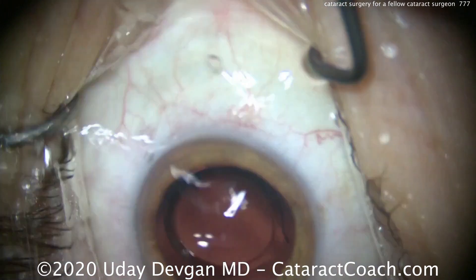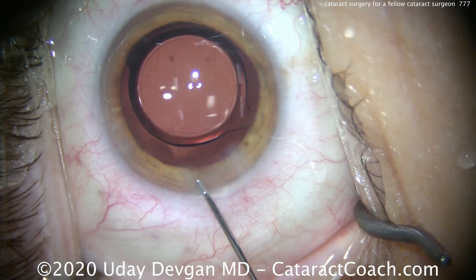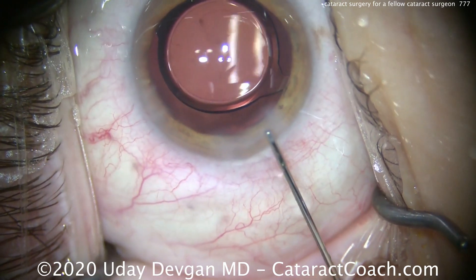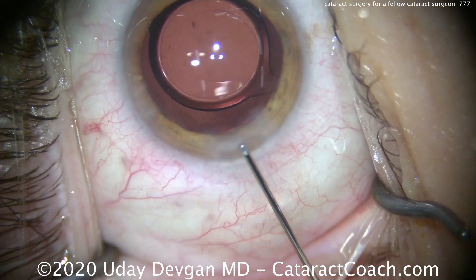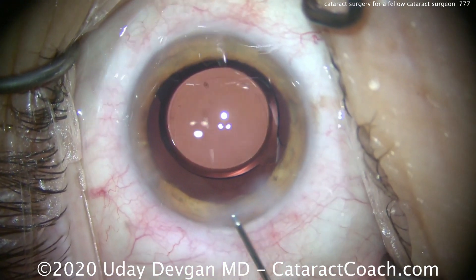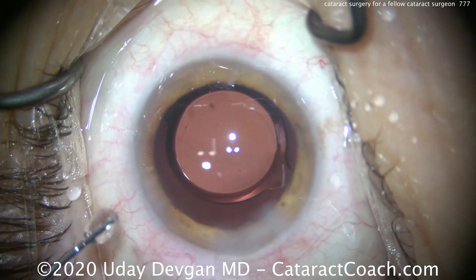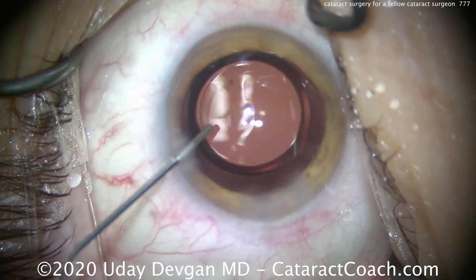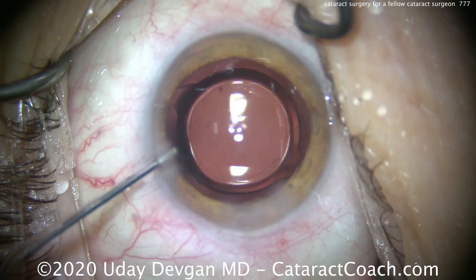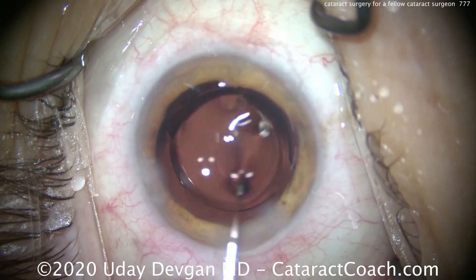It is always an honor to operate on a fellow ophthalmologist — it really is the biggest compliment any surgeon could receive. If you're a patient watching this, ask your fellow eye surgeons where they would go if they had to have surgery. There are a lot of great choices across the U.S. and around the world, and anyone devoted to learning about cataract surgery every single day is going to be among your best surgeons. Thank you to the patient, and thank you for supporting CataractCoach.com. Finally, we seal up the paracentesis — looking good.